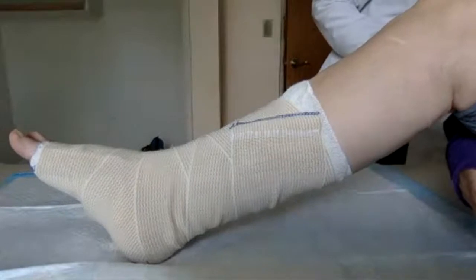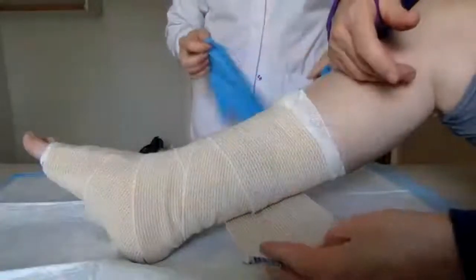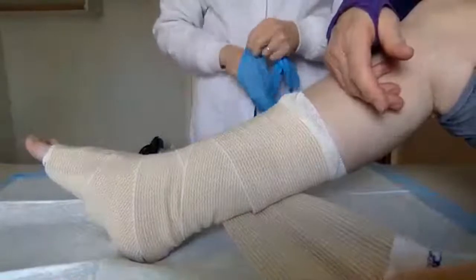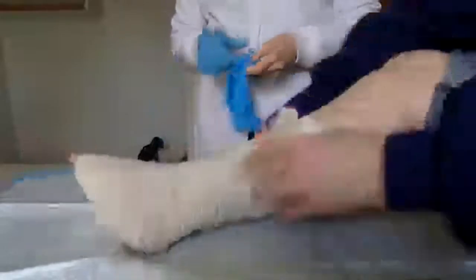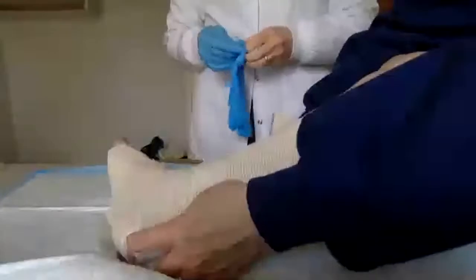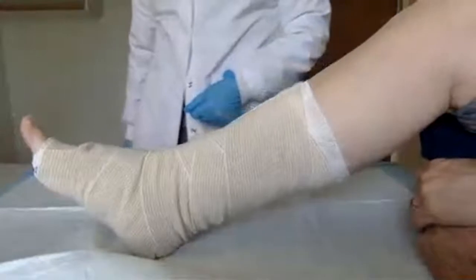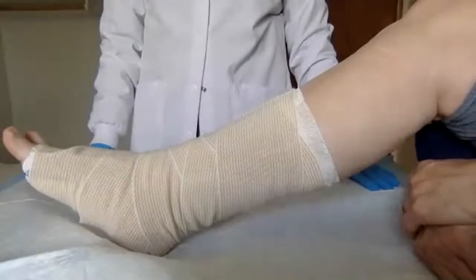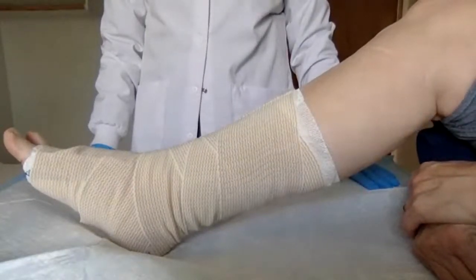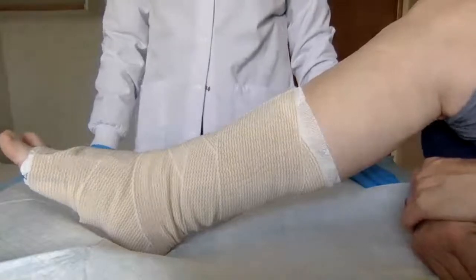Also the stretch. As far as the stretch goes on any ace wrap, you might want a 25% stretch, but you don't want 100% stretch. If you stretch at 100%, then it's going to be really tight on the leg, and you're going to cut off circulation. When you break this heel open, you can check for perfusion just like you would a cap refill, the same with the toes. So don't wrap it too tight, but don't wrap it too loose. It's going to be kind of a guessing game in the beginning, but you don't want 100% stretch and you don't want 15%. You want around 25 to 30% stretch, which means it's about 20 to 30% longer when you stretch it. Hopefully that makes sense.